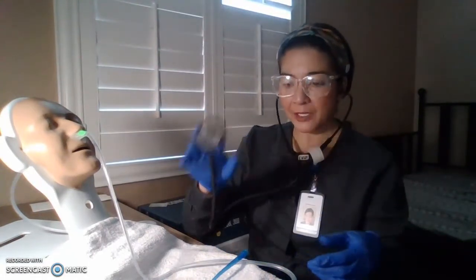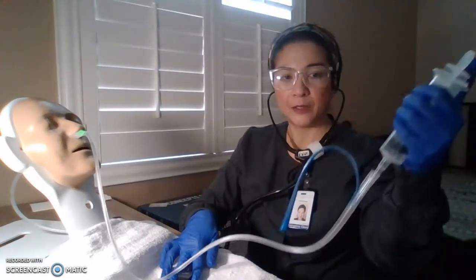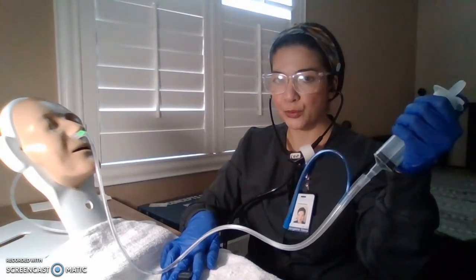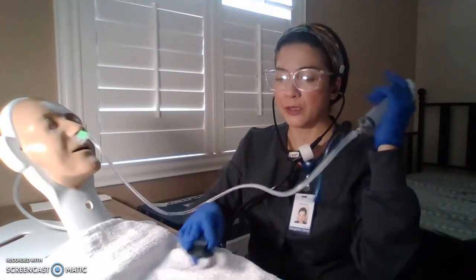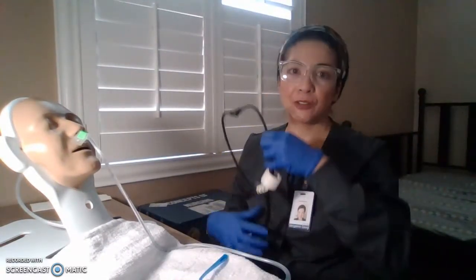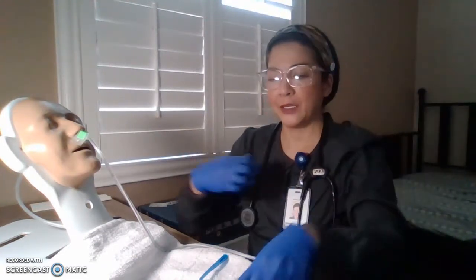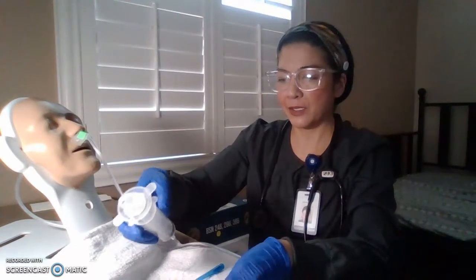Place it on the epigastric area, diaphragm. Okay, ready? 1, 2, 3. And you will hear that. Technically it means that you're in the right area, but it is good to double check.